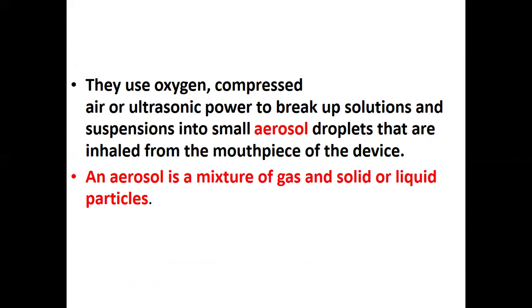Okay, moving on, they use oxygen, compressed air, or ultrasonic power to break up solutions and suspensions into small aerosol droplets that are inhaled from the mouthpiece of the device. An aerosol is a mixture of gas and solid or liquid. So this suspension fluid, normal saline, as we discussed earlier in humidification, will be broken down into aerosol droplets. This could be like the droplets we see in perfume, which is also put up in a compressed can like that.